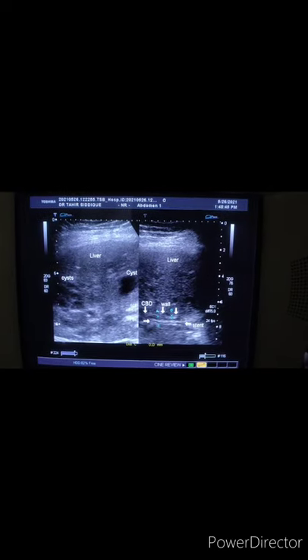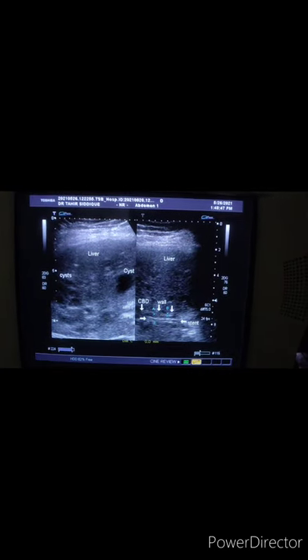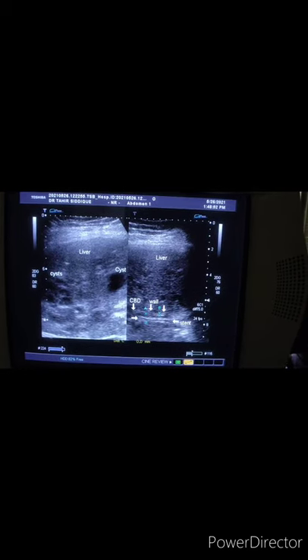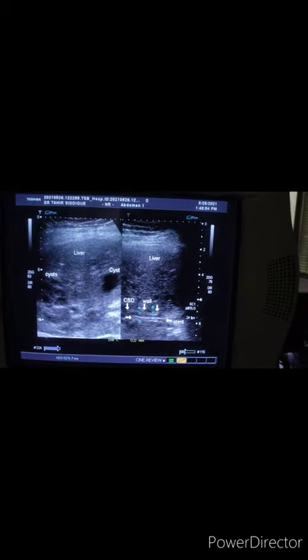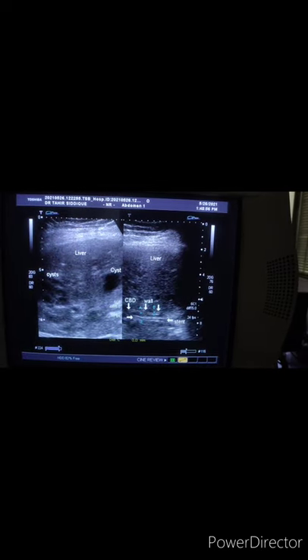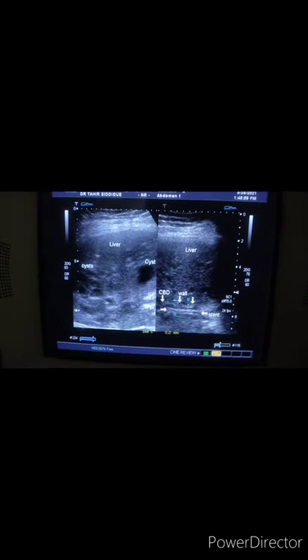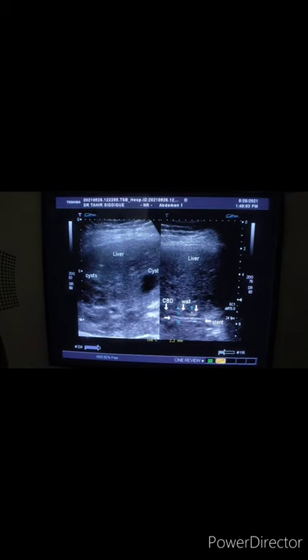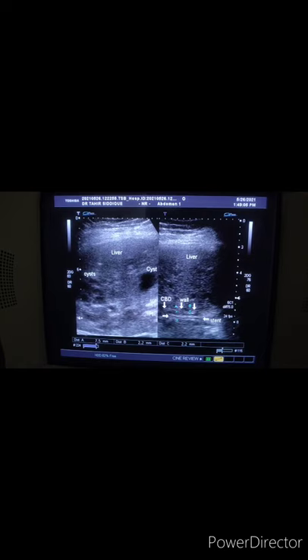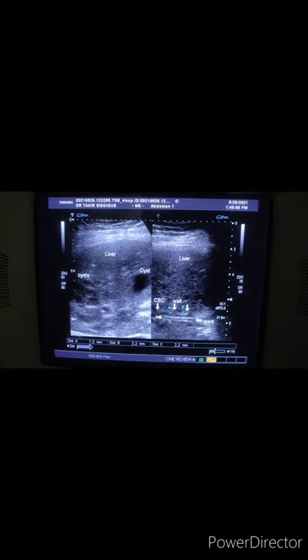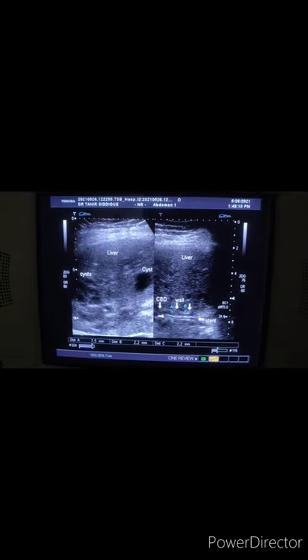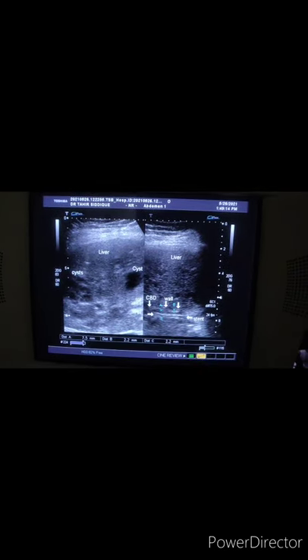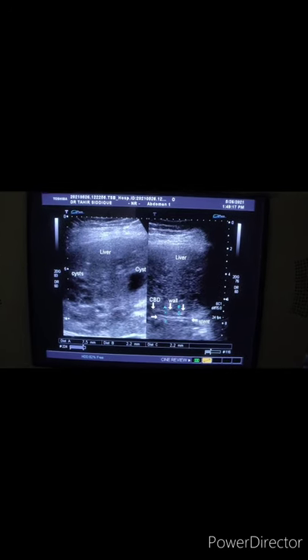This is the common bile duct. This white band of tissue you are seeing is the wall of the common bile duct. The wall of the common bile duct measures approximately 2.2 mm, which is significant because the normal range is 1.2 to 2 mm. So this is suggestive of cholangitis.